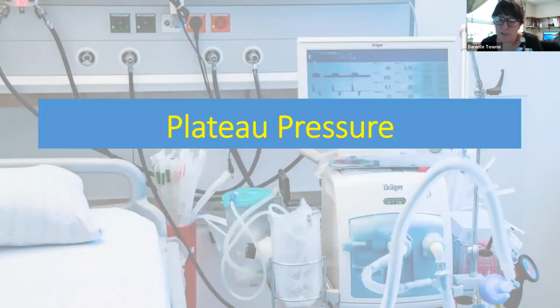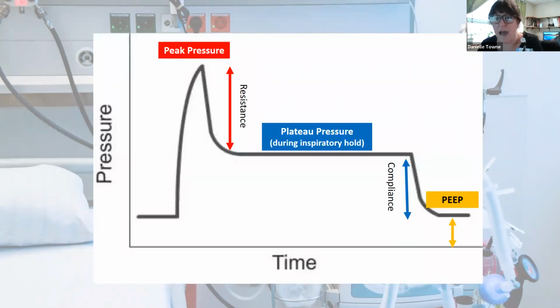Now, our plateau pressure is also a part of this graph. Plateau pressure is also called P-plat, and it's something that you, again, don't set on the ventilator. The plateau pressure tells you about the patient's pulmonary compliance. Our goal is to have this number be less than 30. It's measured by applying a brief inspiratory pause after ventilation.